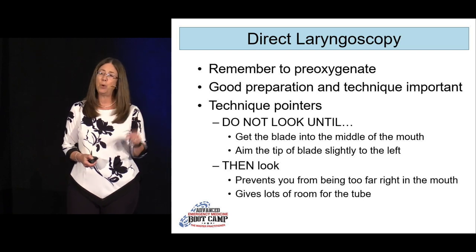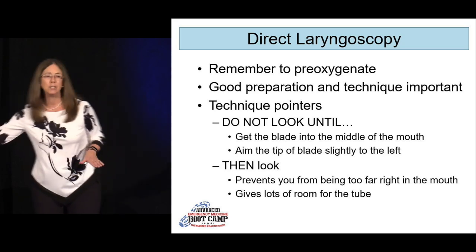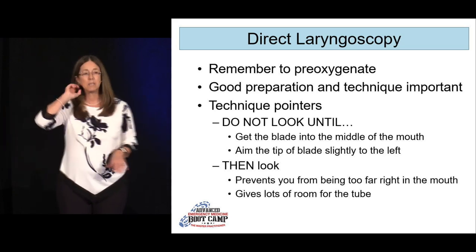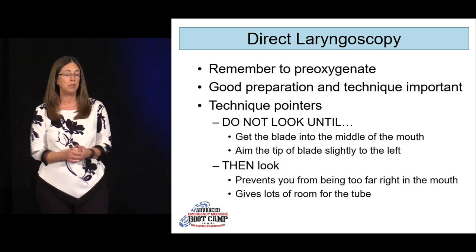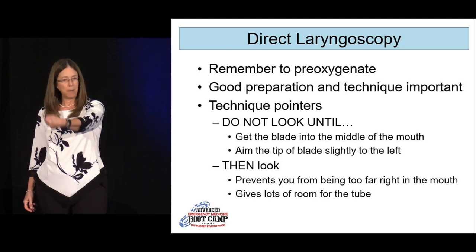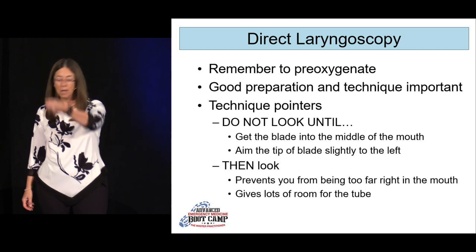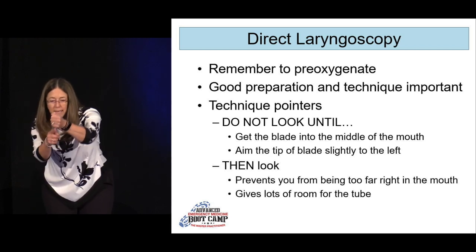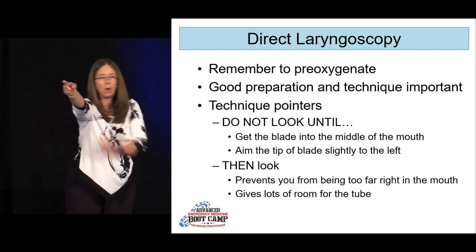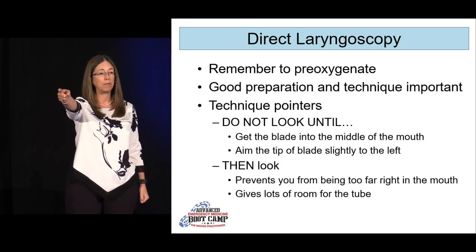And a couple technique pointers, as having taught for 30 years in an emergency medicine program, over and over again, I see certain things happen. One of them is, especially as people get comfortable and kind of cocky about intubating, they'll take that laryngoscope, put it in the right side of the patient's mouth and sweep to the middle, but not always right in the middle, looking the whole time. So it's in, I look, and the problem is that I can see some cords, except now my laryngoscope is pointed at the patient's right foot, and it's not in the middle of the patient's mouth.